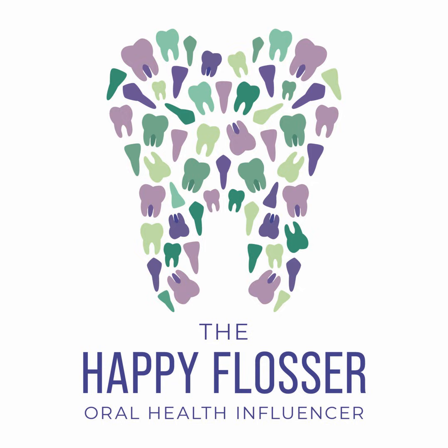So it's really important that you get a systematized approach so that you don't miss anything when you're taking a look at your patient. And when I mean by looking at everything, when you're in school, they kind of give you like a checklist, a cheat sheet of everything you should look at. That's why they do that. They want you to get a system down so that if in fact you do have a crazy thing show up on a radiograph, you haven't overlooked some of the important things that you need to.